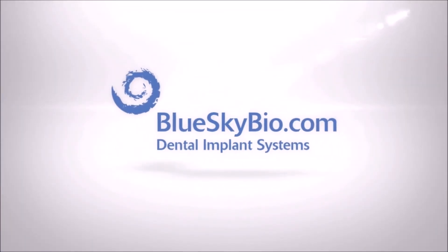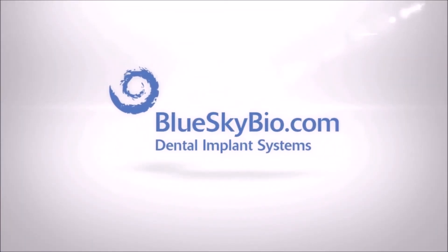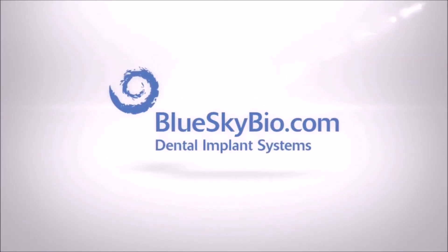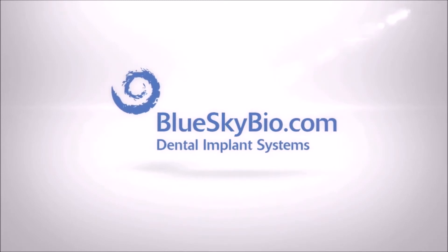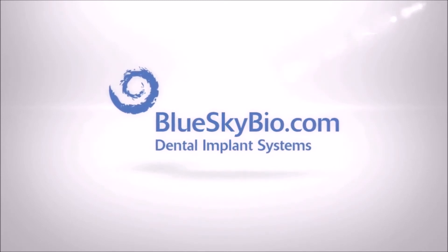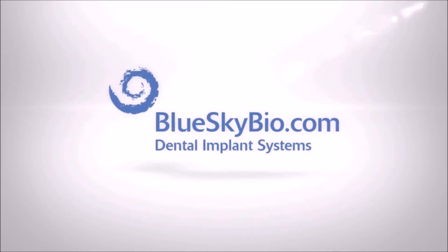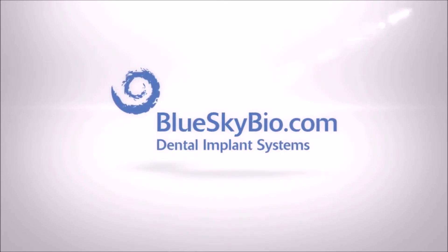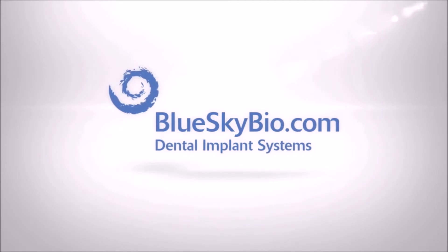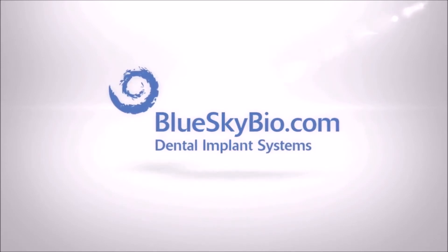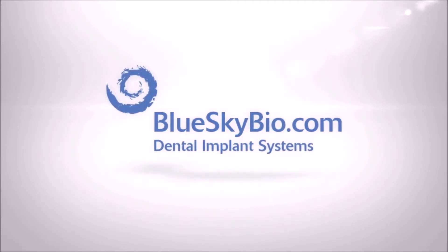This is a basic training video on how to treatment plan and create a surgical guide using the teaching case associated with this video. This is the recommended procedure for your own cases and is especially ideal for extensively restored dentitions.